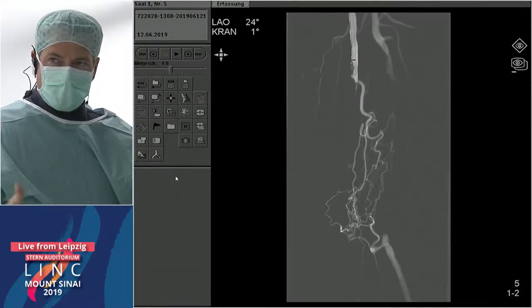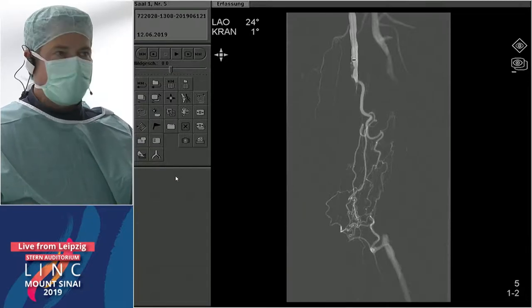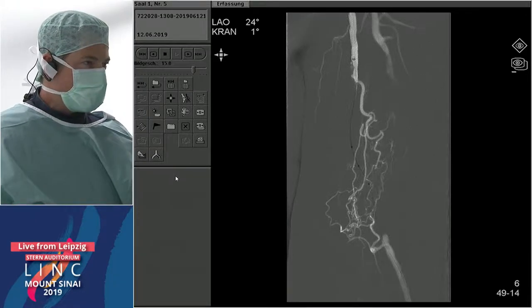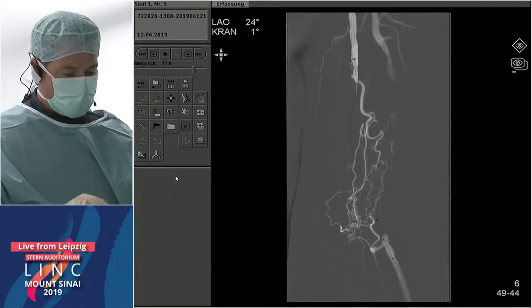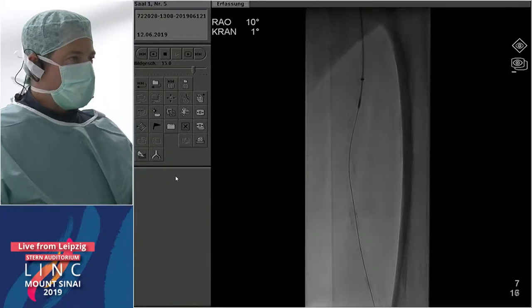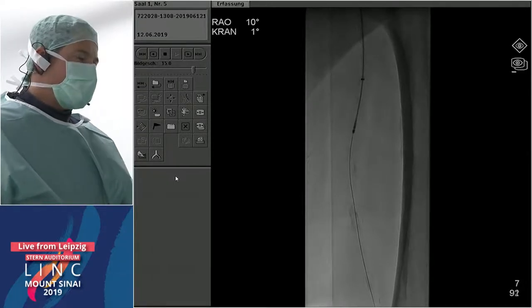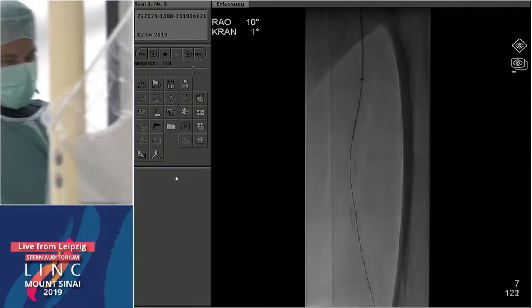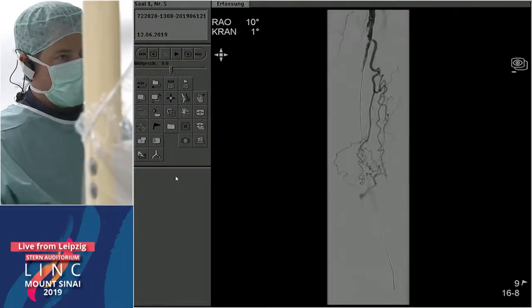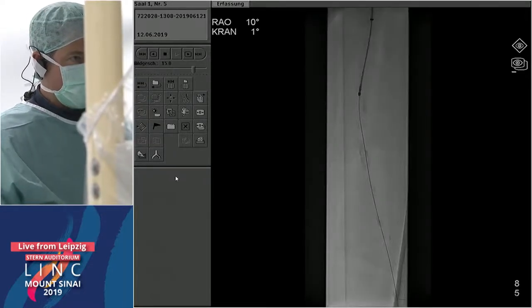First I had to open this lesion. I could pass a wire down relatively easily — this is a PG2 wire and a QuickCross catheter — but it was a little too easy, suggesting thrombus. That's why I used the Rotarex. I placed a 6 French 45-centimeter sheath and integrated with the Rotarex. I could achieve some flow, but distally there was still an occlusion, which I did not Rotarex.